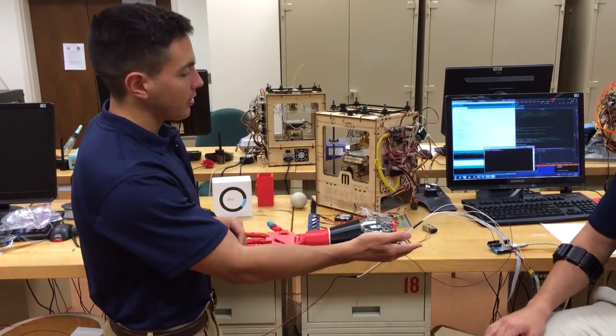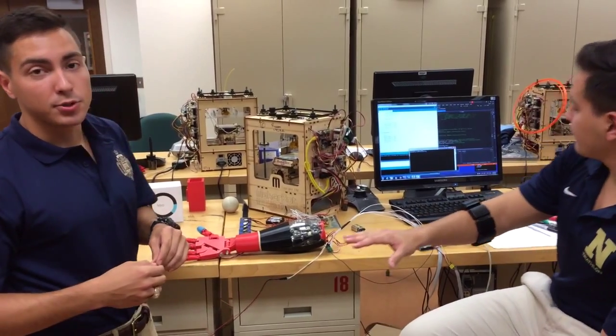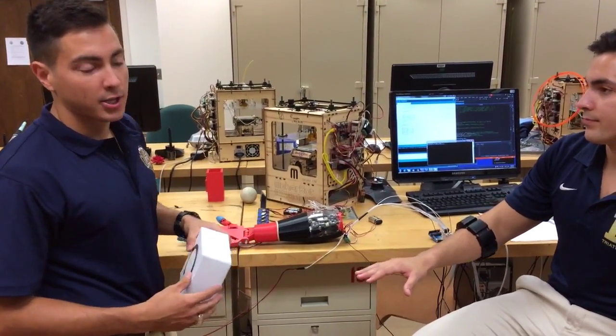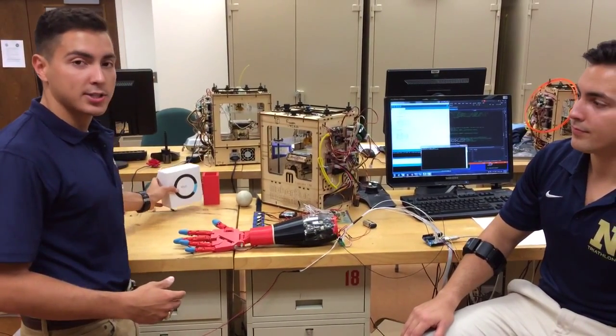To control it, we use the Myo armband, which signals to the PC via Bluetooth. It's from Thalmic Labs, and this is a development package, so it's the first time it's being applied for this prosthetic use.